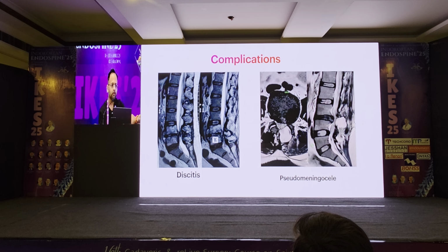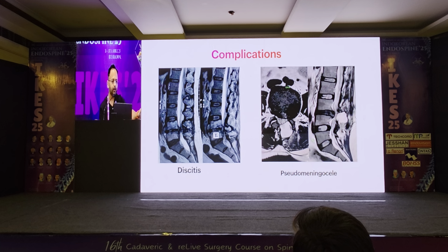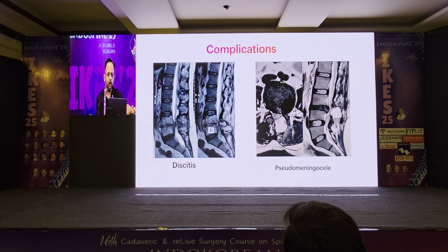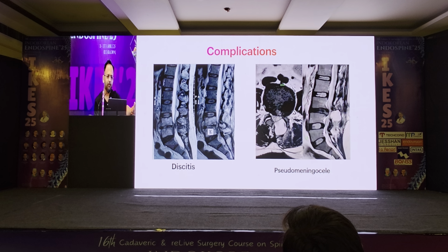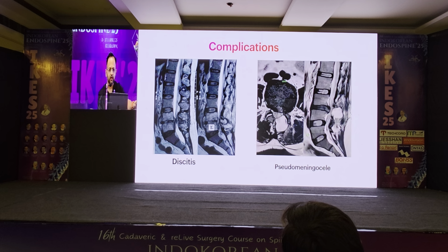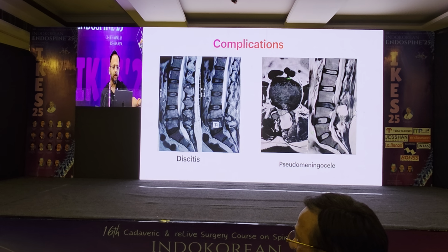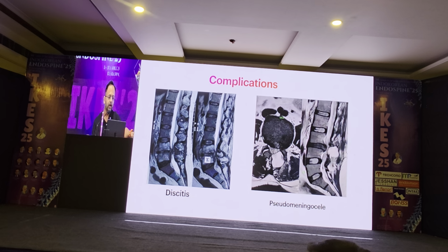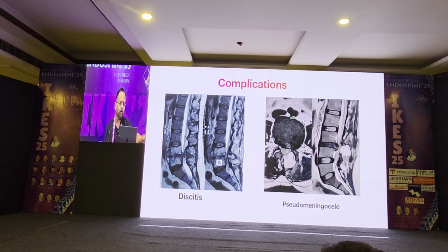In India we don't have TachoSil, we have something called Duragen. Duragen swells up a little in the irrigation, but still it works well. There is also bovine collagen graft, not very costly. Once you pick up endoscopic spine surgery as your personal entity, you can get it for 35-40,000, but it will come for around 8 to 10 cases if required. You can just cut a small piece, it does not swell up. I have a video tomorrow, we do something called inlay grafting. Onlay grafting is also accepted, but there is something called inlay. Inlay, the advantage is it is more successful and more water sealant.